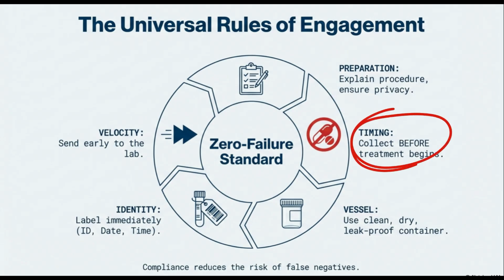Next up is timing, and this one is huge. Always collect the sample before any treatment starts. If you don't, the medication could kill the parasites and give you a false negative.